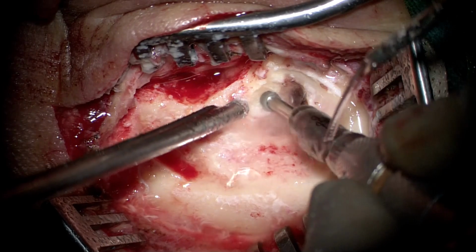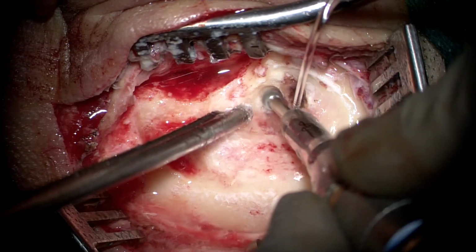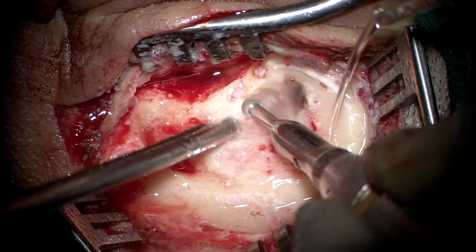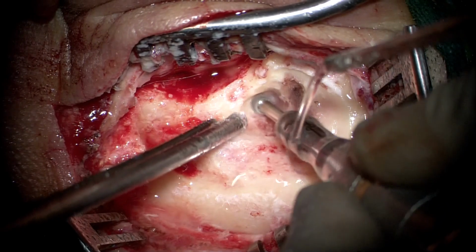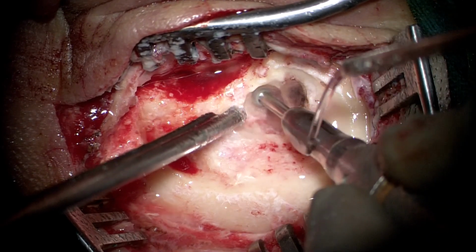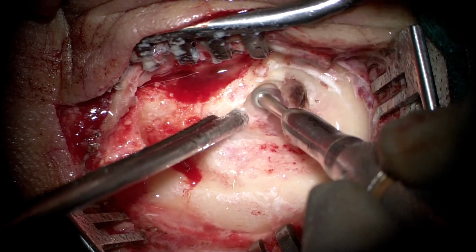labyrinthectomy. Here we would need to decompress some bone around the dura and the sigmoid sinus after completely unroofing it to be able to achieve that space where we can drill the posterior and the superior semicircular canal comfortably and gain that posterior trajectory of vision inside the vestibule.